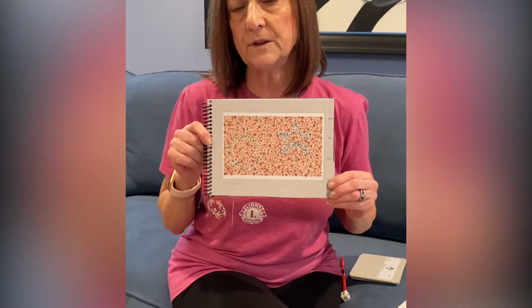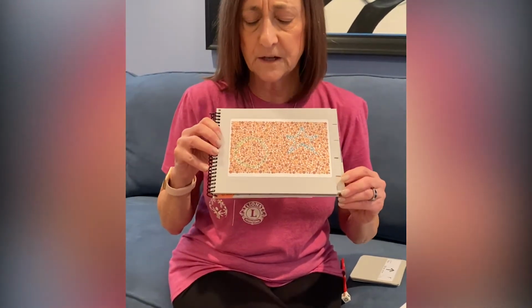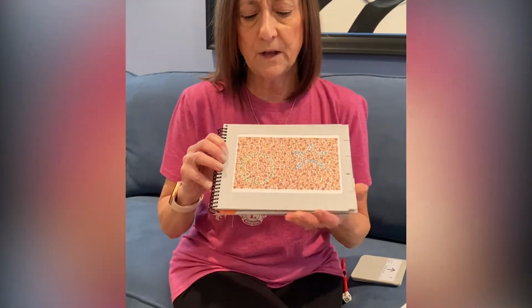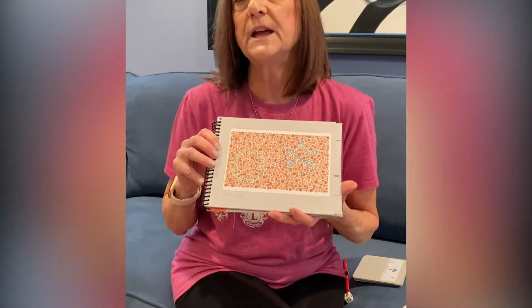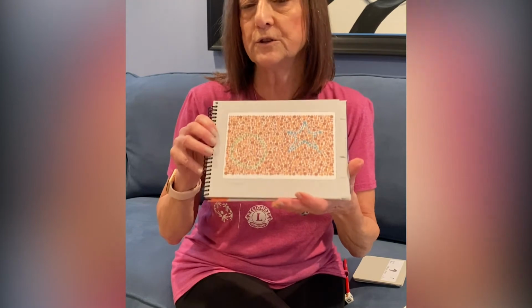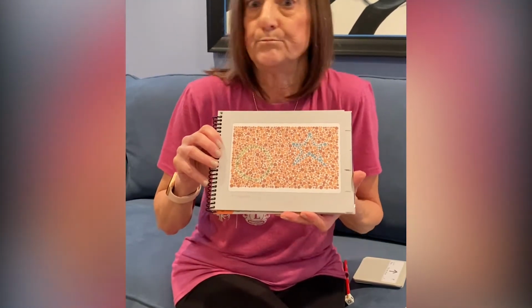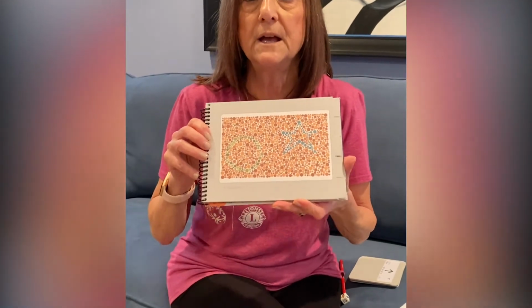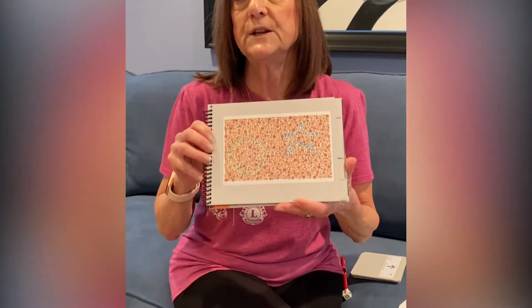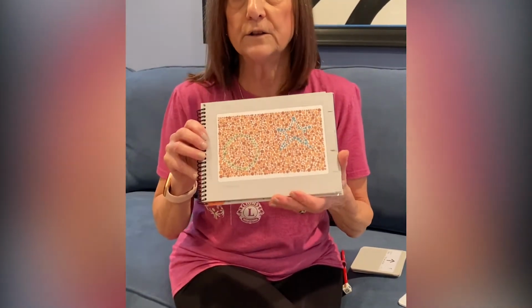The reason we do that is there's a bit of a learning curve associated with understanding what we're asking the athlete to do. So we'll ask them to go through it a second time when they have a better understanding, and we've given them lots of reinforcement of what they've done through the first trial. And we will record both trial 1 as maybe 6 out of the 9, and then trial 2, 9 out of the 9 is a pass. If they get less than that, we would say that they potentially have a color vision deficit.